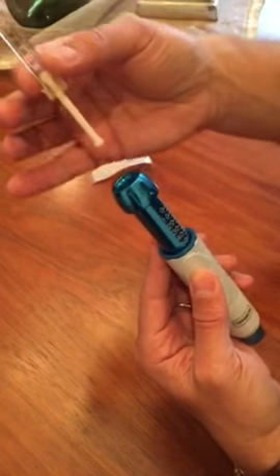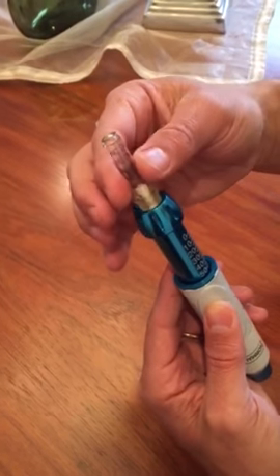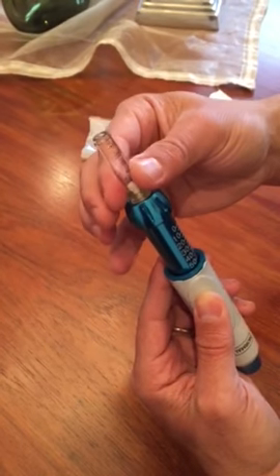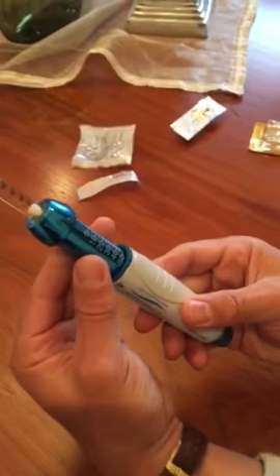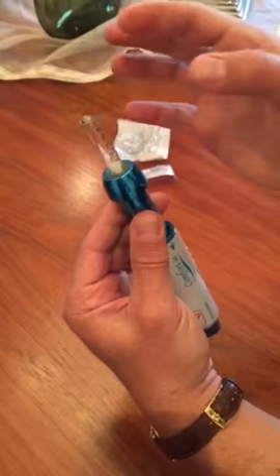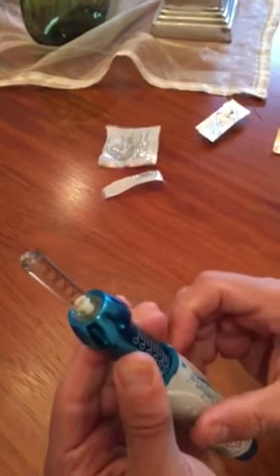Hold the injector with one hand, insert the syringe with the other end, and screw it in properly. Now turn the dial, and as you turn it you can see that excess liquid will come out.